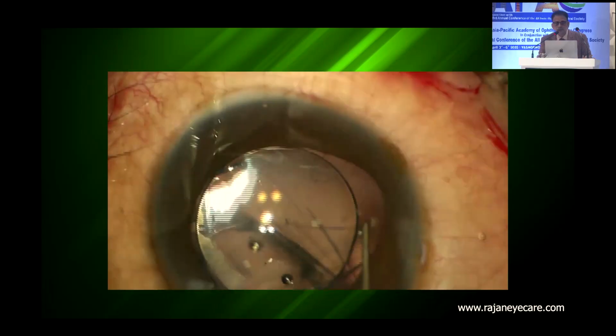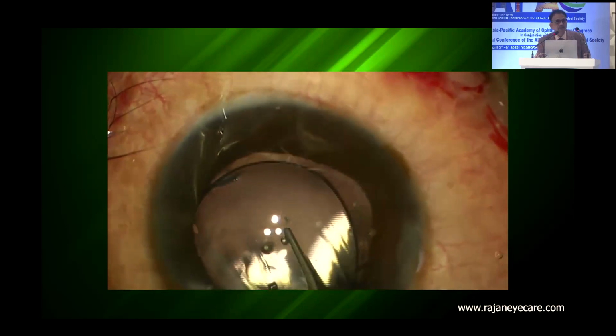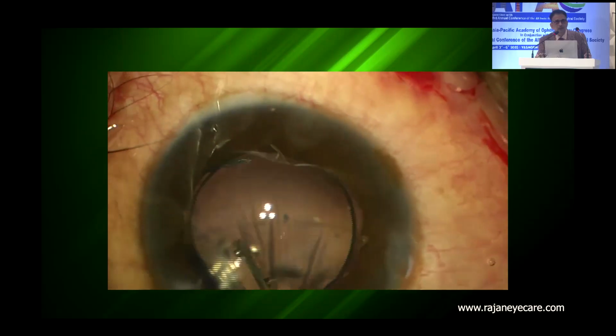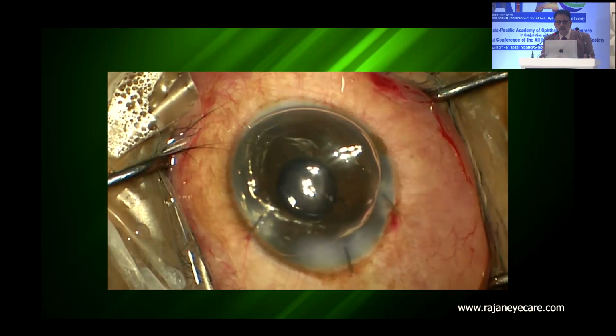So what is this thing? You put a lens in the sulcus. Don't leave it in the sulcus. This is a 3-piece lens in a posterior polar cataract. Obviously you can't put a lens in the bag. If you leave it in the sulcus, what will happen is, it will decenter.